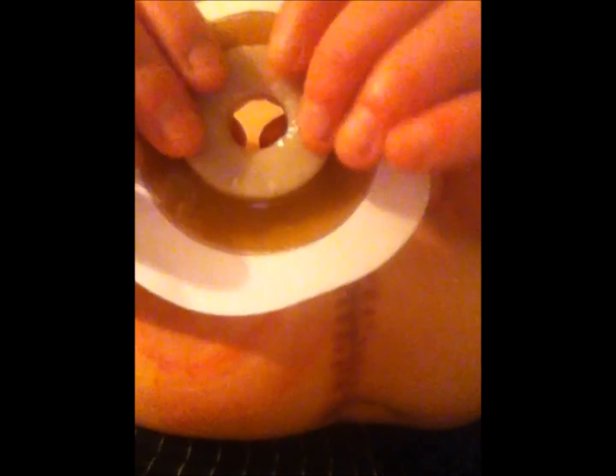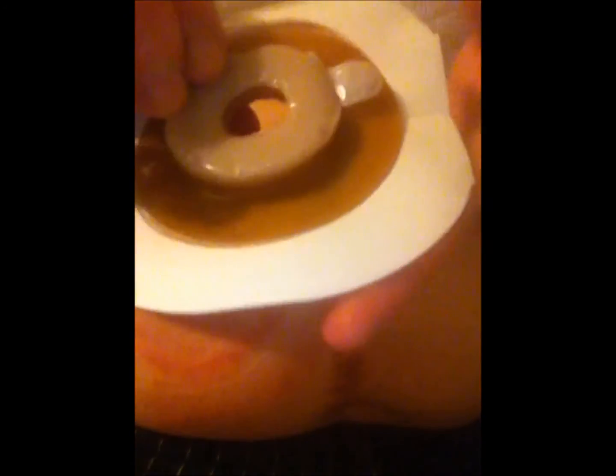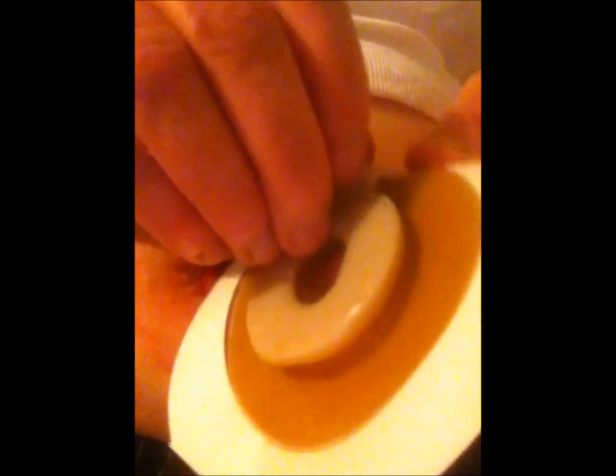And what that creates for me is a little bit higher convex. So when it pushes into my belly, it has a tendency of pushing this out. It will push this out like that, so the urine will go inside the bag and not on my belly. So that's really important. So I'm taking that off, and I kind of make it.